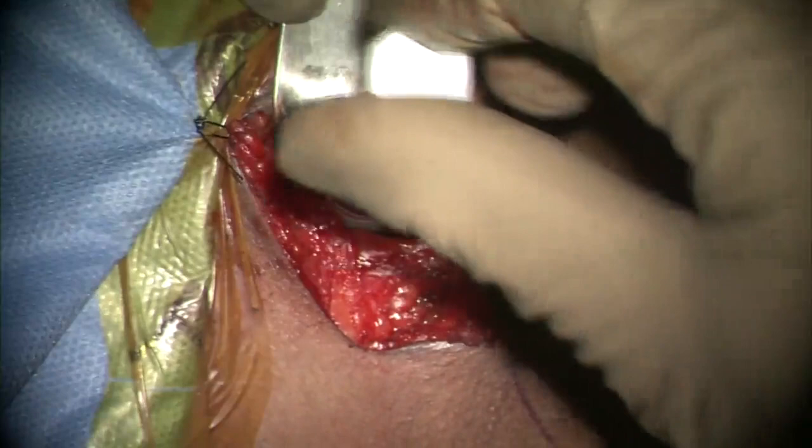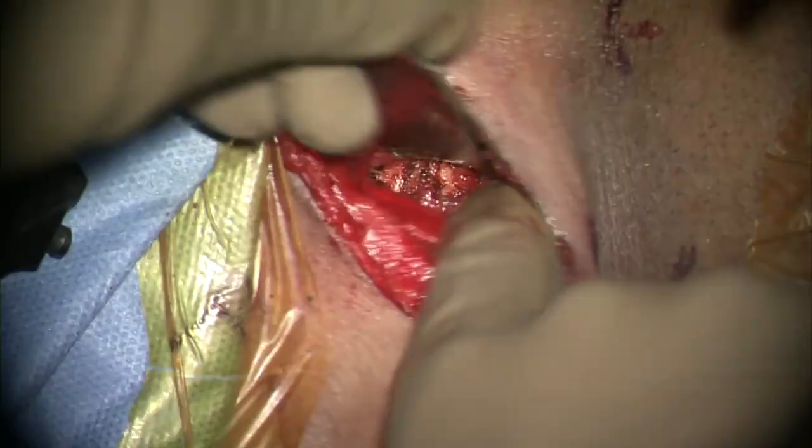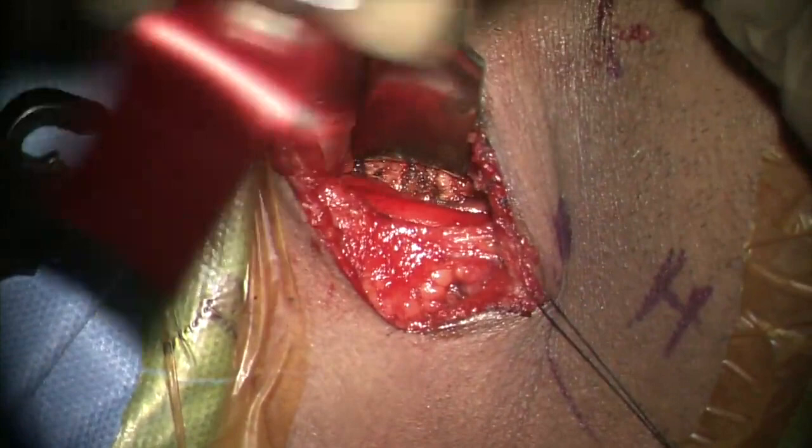After measuring the depth of the incision, self-retaining retractors are applied and care is taken that there is no herniation of the muscle or the esophagus from under the blade.